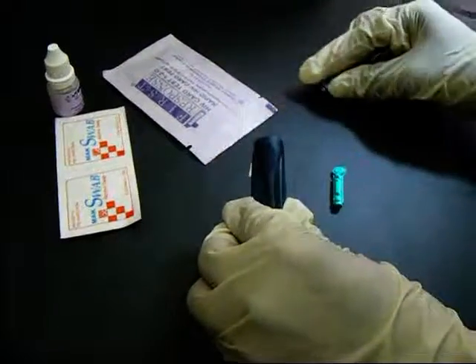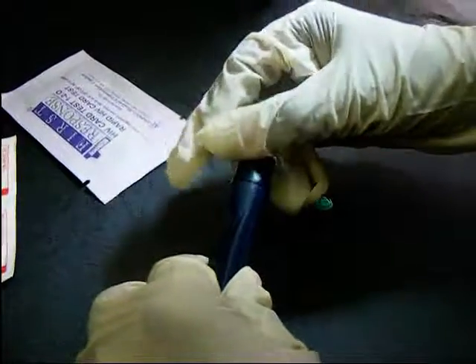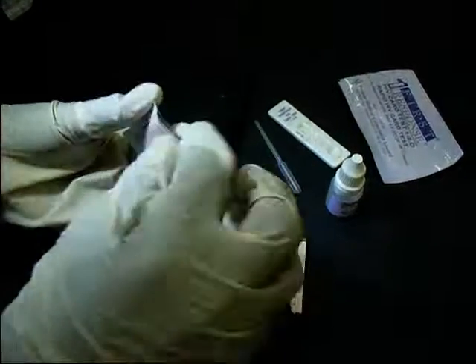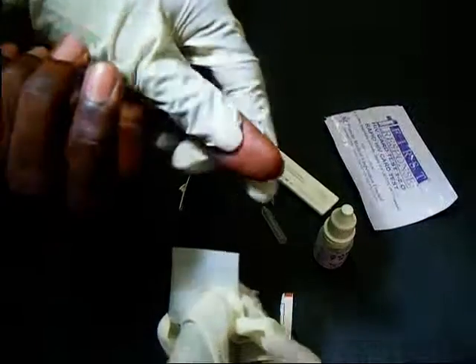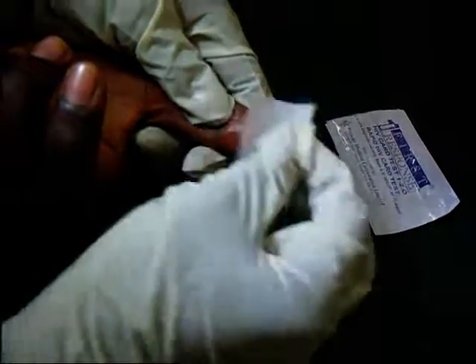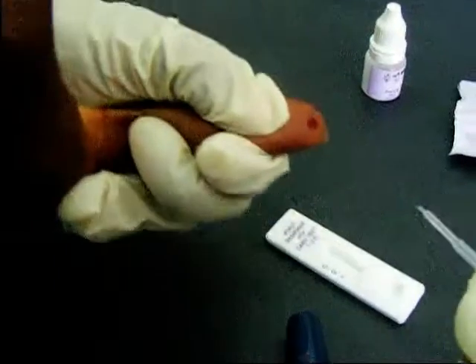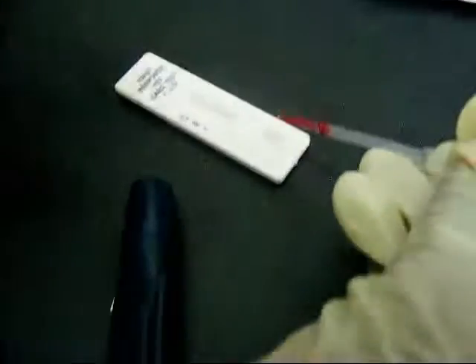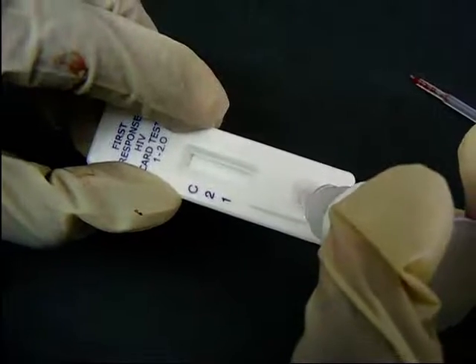The lancet is fixed onto the lancet holder and made ready for use. The lancet is used to prick the tip of the thumb, and the blood is collected with the pipette and transferred into the sample well of the test device. Two drops of the assay diluent are dropped into the same well and the device is allowed to develop.